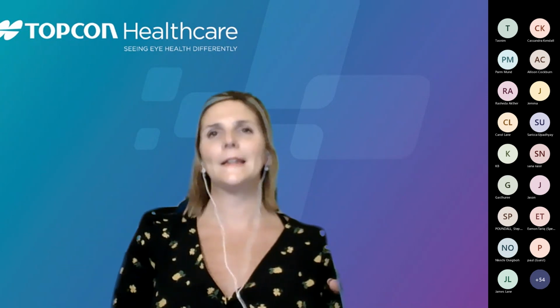I would say the biggest tips for me as I've gone through my interpretation journey is really just looking at images. The more you learn, the more you look at them, the more you see them, the more you start to understand what's normal, and pulling that information in along with everything clinically. Don't ever forget that. You've got a massive clinical background, so please do use that to help you with your interpretation.